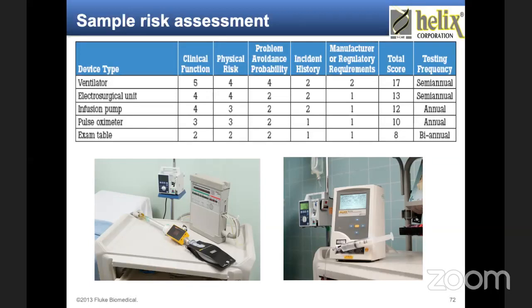The patient will not tell if he is getting shock. The surgeons are using slippers for doing the surgery, so nobody will tell. And the patient is in deep anesthesia. He also will not tell that he is getting shock. So you want to see whether the patient is getting shock or not. Come out of your slippers. Now touch the patient. You will know whether there is a current passing through the patient.